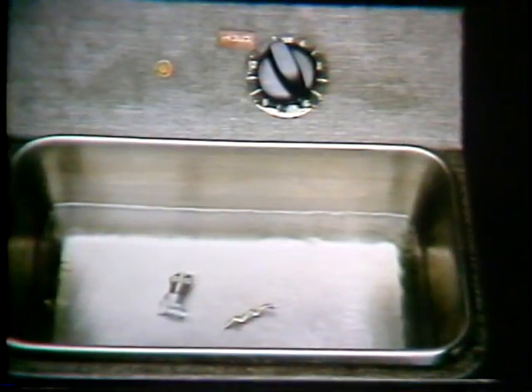The latch-type contra-angle can be cleaned ultrasonically, but not in general-purpose cleaner, which will rust the bearings. Use water or contact a Midwest representative who will recommend an ultrasonic cleaner to use.